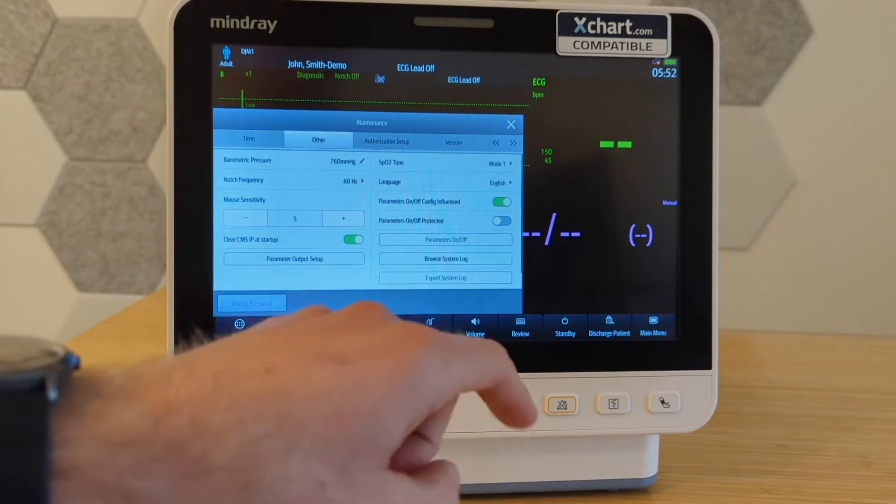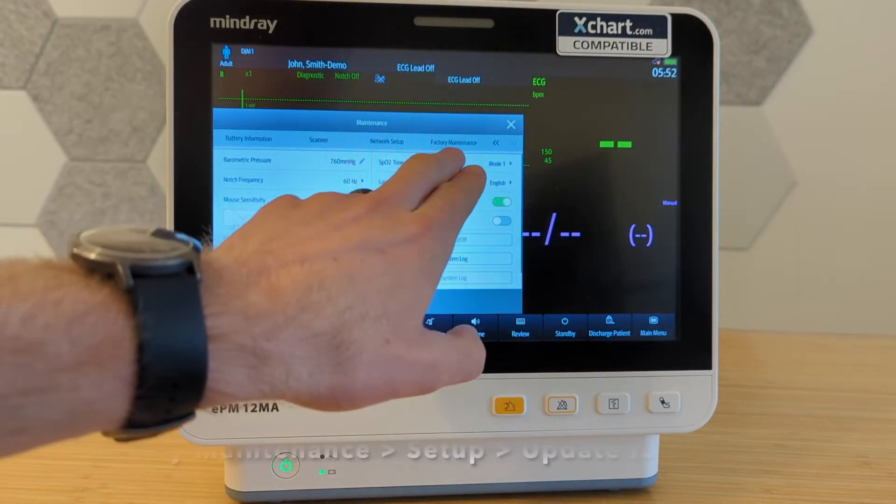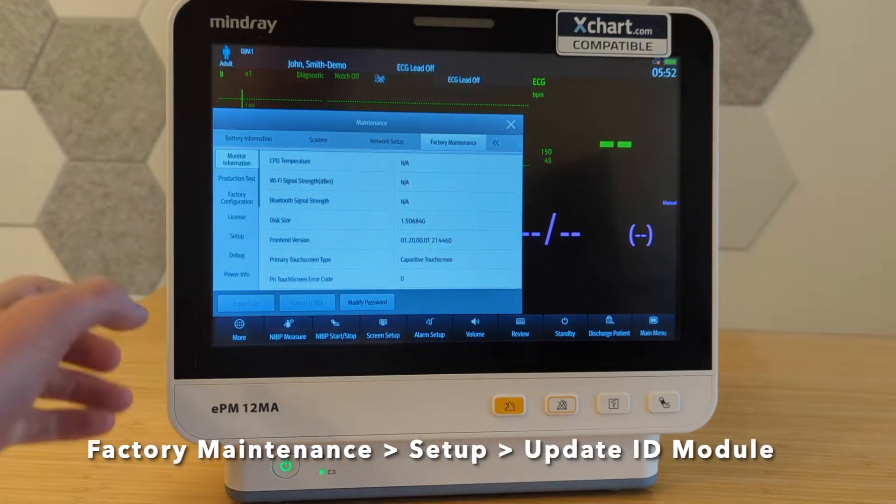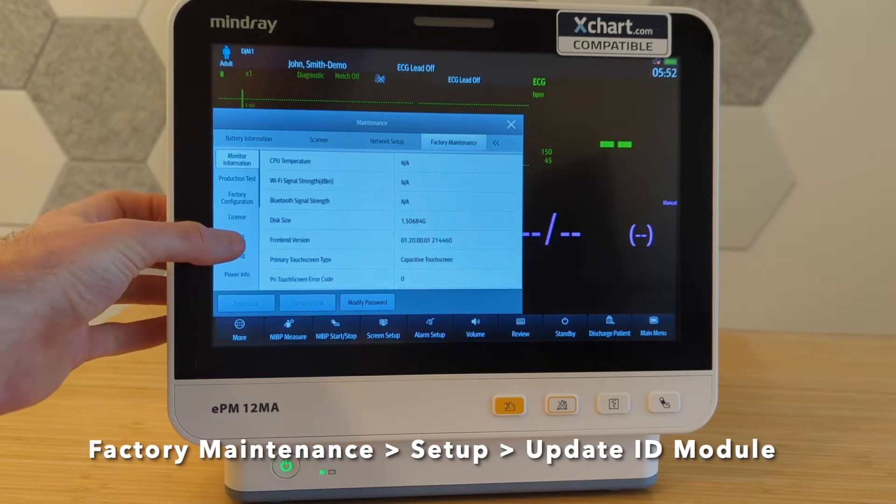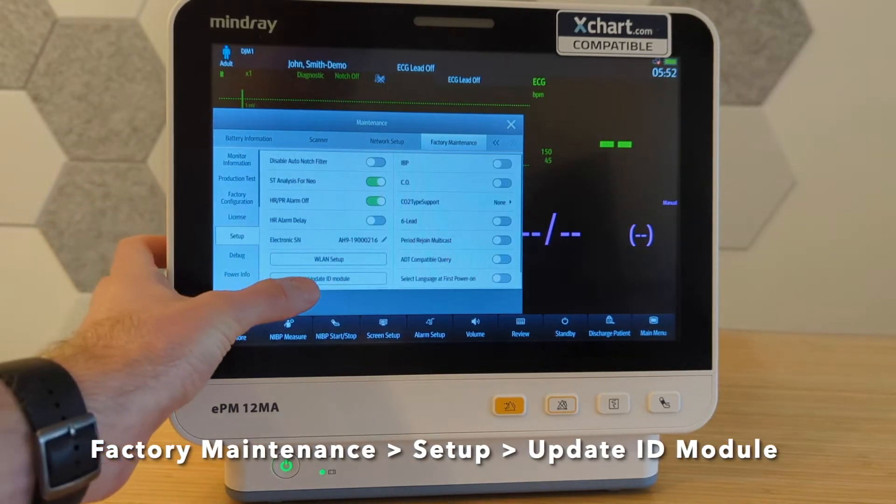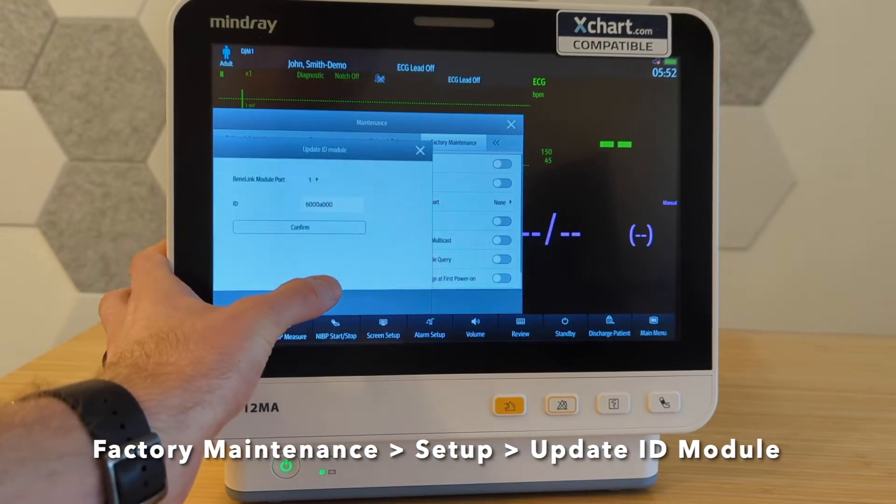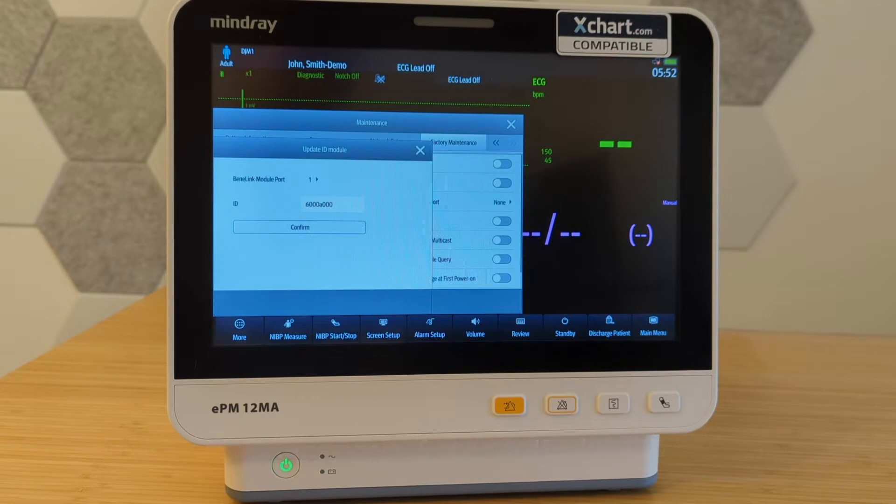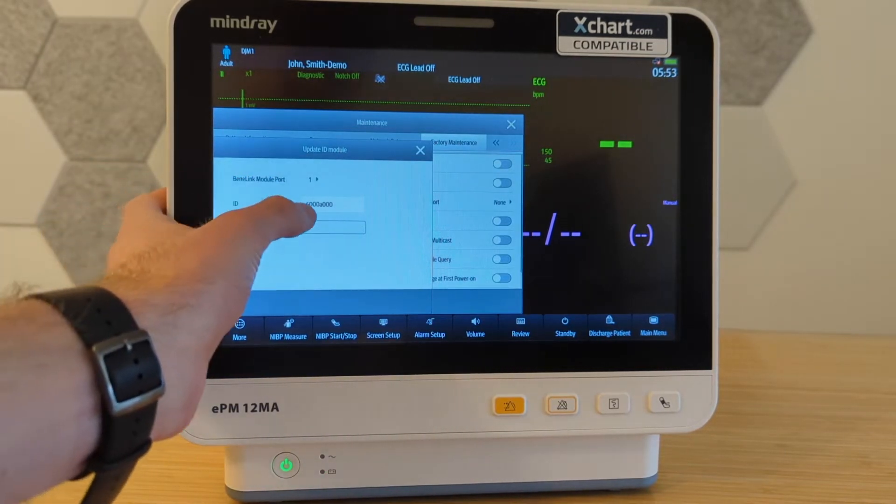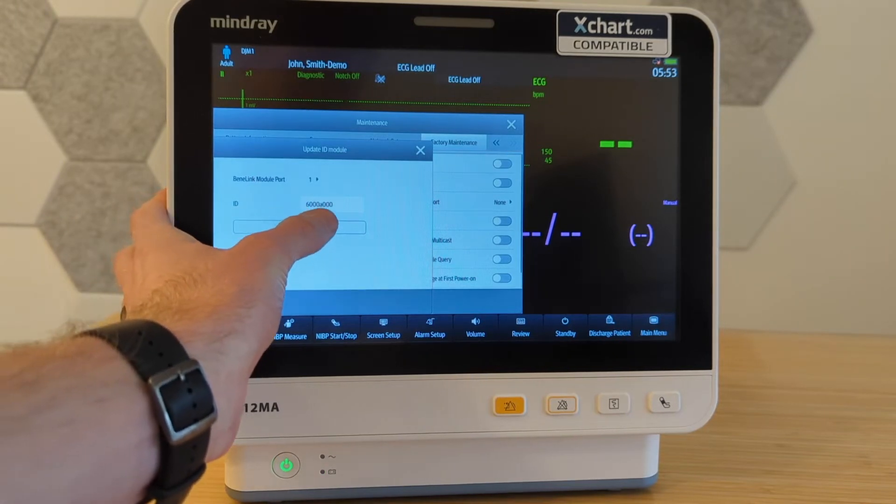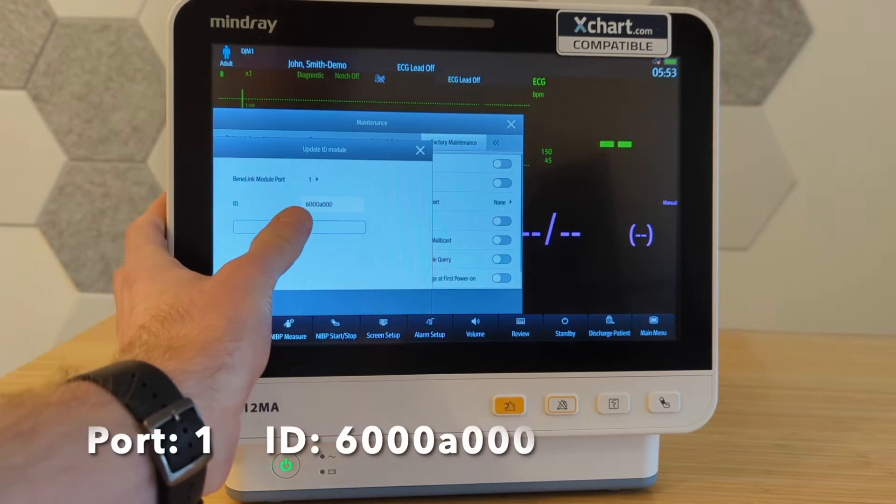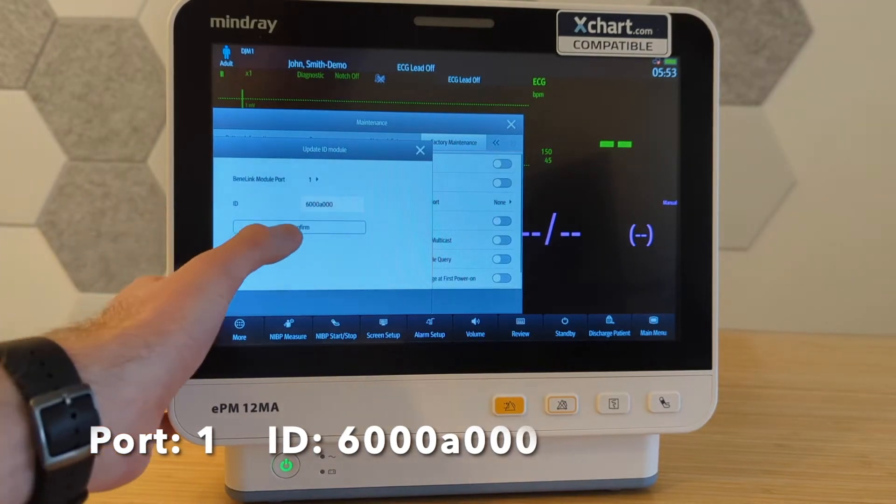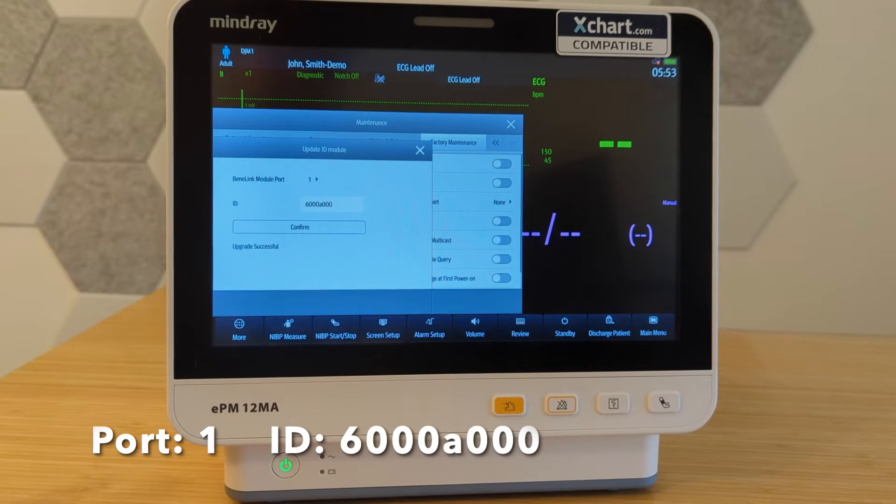The second thing we're going to need to do is we're going to go all the way over to factory maintenance. And then on the left-hand side here, you want to select setup. And then we're going to click update ID module. So this ID module needs to be the code that you're seeing here on the screen. First of all, the module port should be one. And then you want to make sure it says 6000A and then three zeros. I'll put it on the screen to make sure it's real obvious. And then you want to hit confirm and the monitor will beep to confirm if you've changed it.